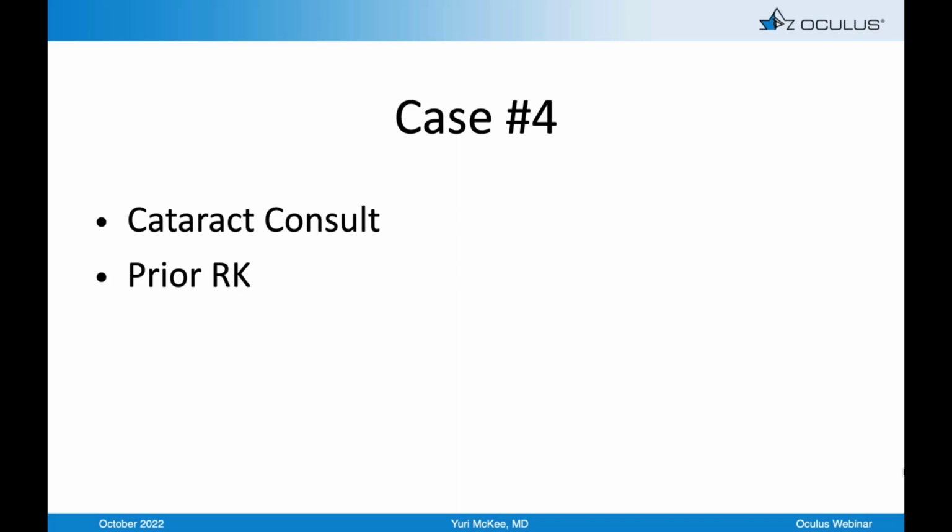That's the worst case scenario for most patients in the cataract age zone, where their pupil tends to max out naturally at around 6. So we're talking about how bad would your vision be at night with car headlights coming at you, and what complaints would you have in that situation?